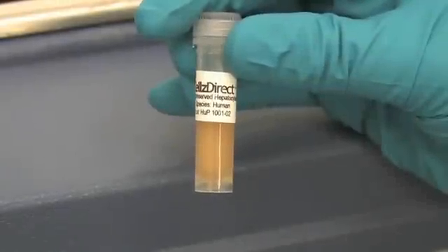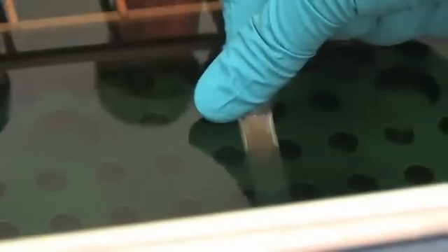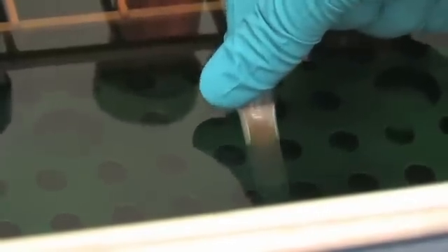Holding vials at the capped end, submerge cells in the 37 degrees Celsius water bath. You can swirl the vial or hold it steady. However, it is important to continuously monitor the vial while it is thawing. This should take less than 2 minutes.